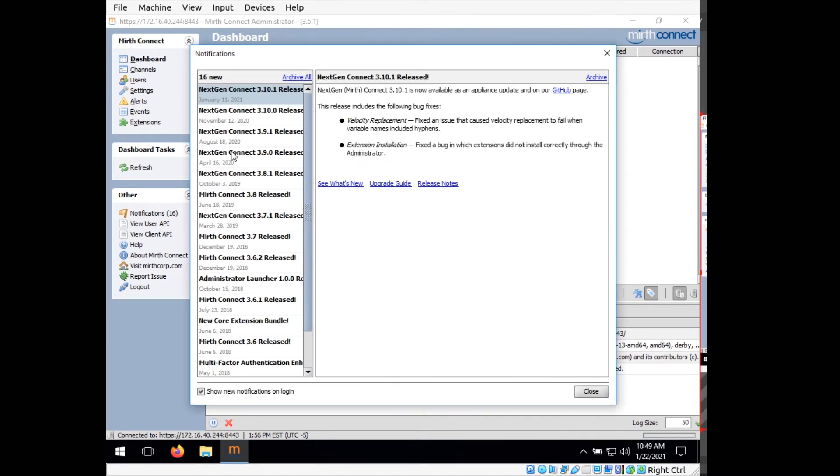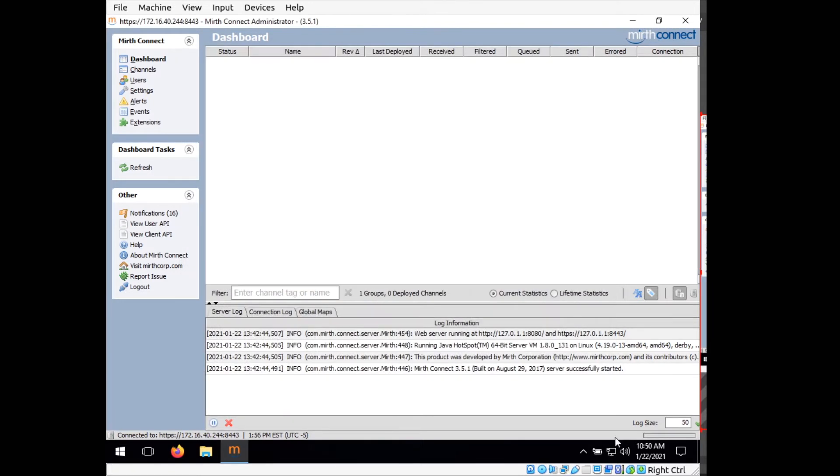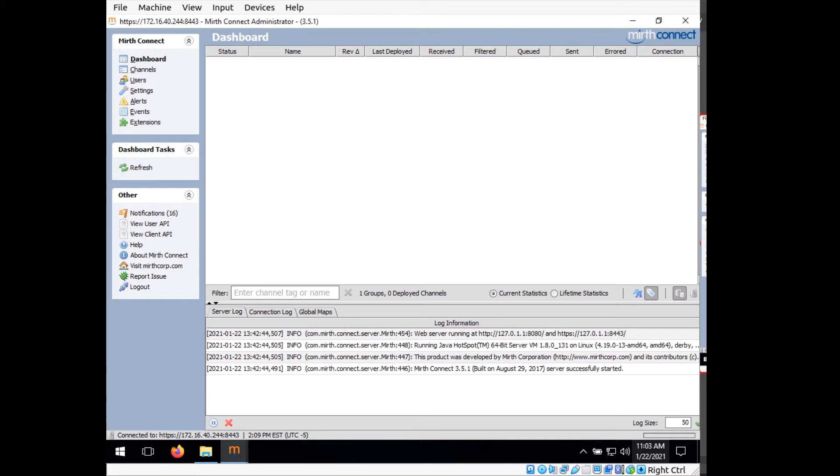And you'll see we have a bunch of update stuff. We want to go ahead and close out of that. And here you can see the main page for the Mirth Connect administrator where we'll be doing most of our work. So now that we have Mirth Connect administrator running, we can go ahead and create the channel that's going to take the HL7 data from the Welch Allyn and convert it to something that the database can read.